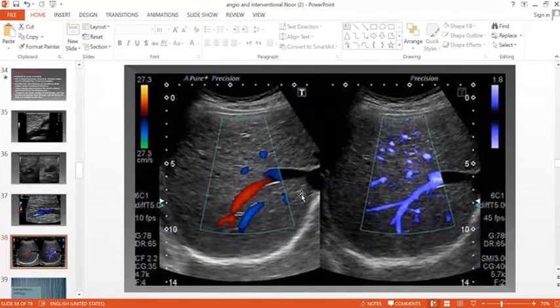thrombosis. Venous Doppler is also useful not only in peripheral veins and detection of DVT, but also useful in visceral veins, such as the portal vein, in the assessment of flow, in the assessment of portal hypertension, and in the assessment of portal vein thrombosis.